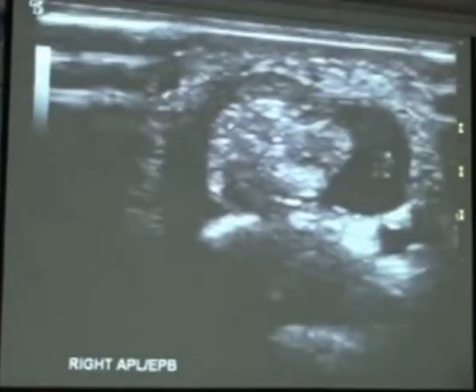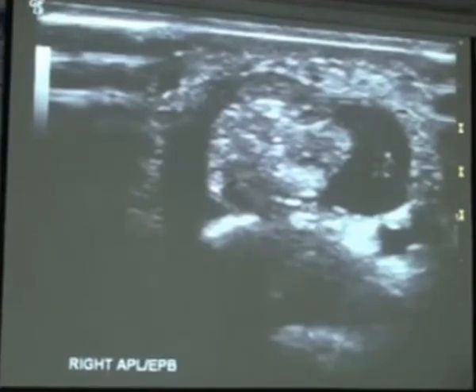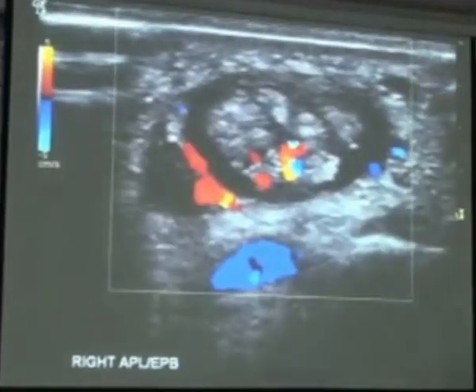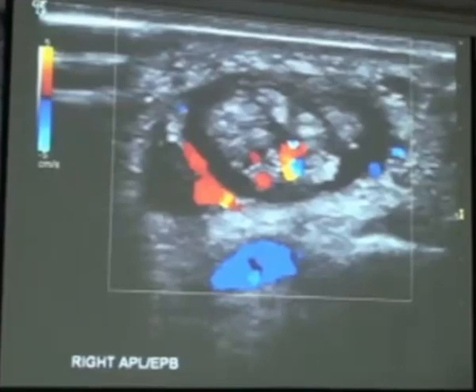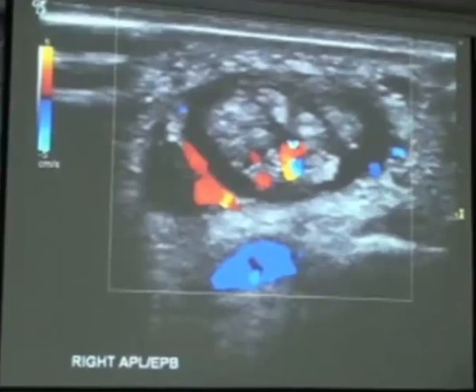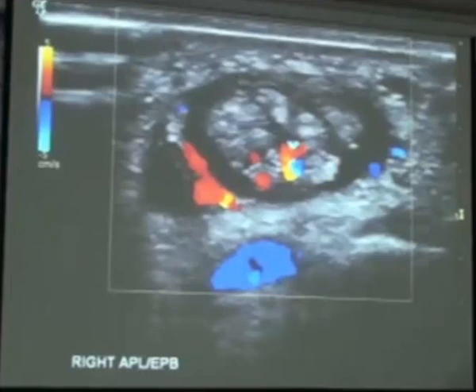This is a case where we've got thickening of the tendon itself and a large amount of fluid sitting in the sheath surrounding the tendon. Using color Doppler, we're able to see hyperemia within the tendon itself. In the APL, it's very common to see little hypoechoic clefts — this is just the orientation of the tendon fibers and is not partial tearing within the tendon.